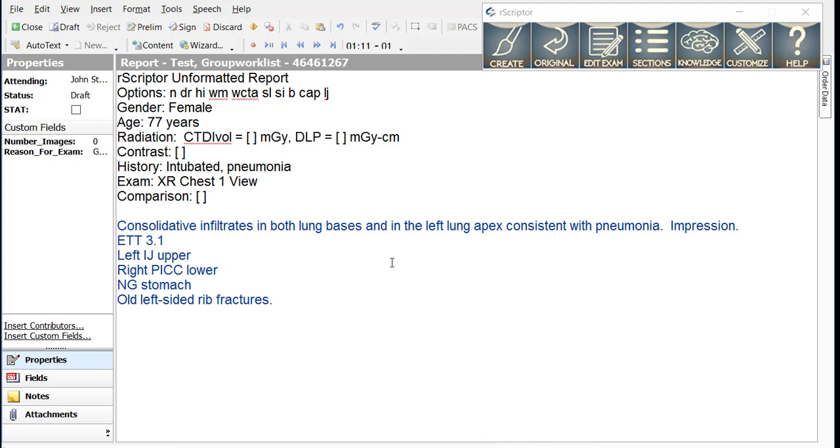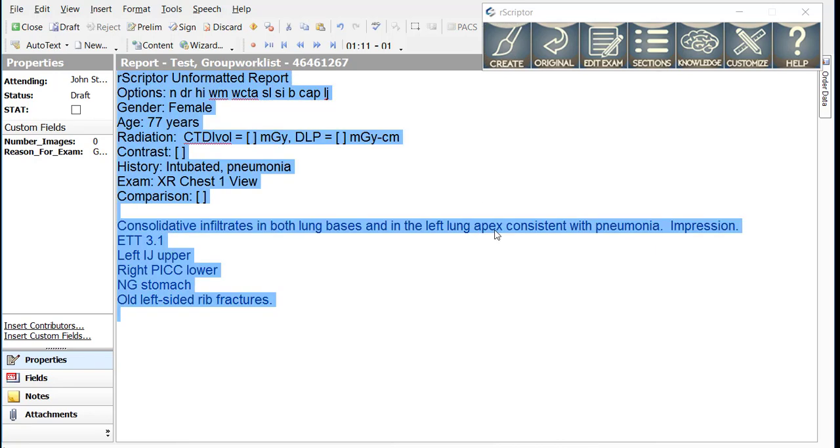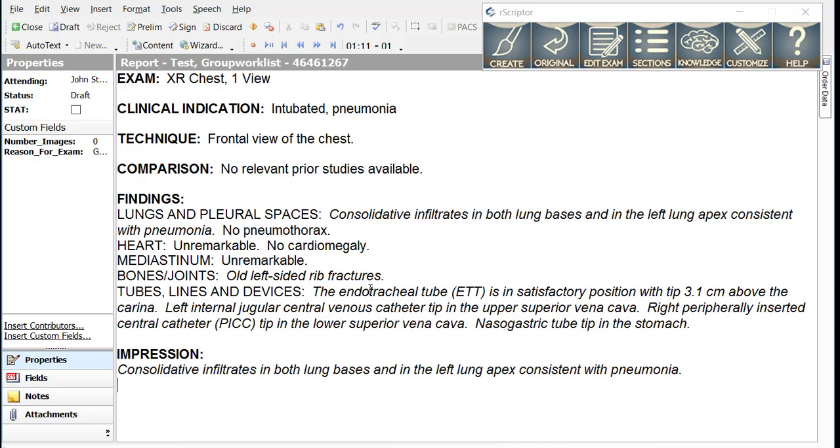When you create that report, you can see that each finding was expanded out into the appropriate text in the findings section. And then the consolidation that we wanted to put into the impression was placed in the impression.